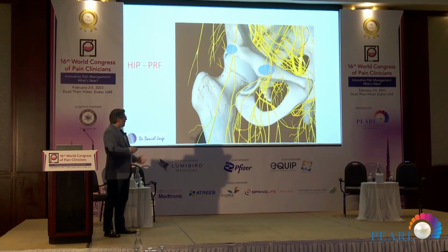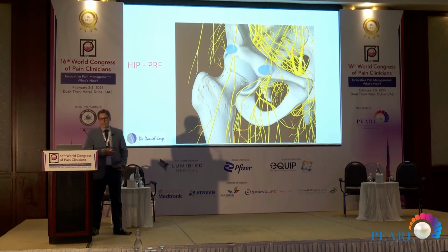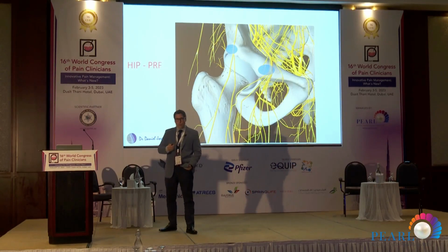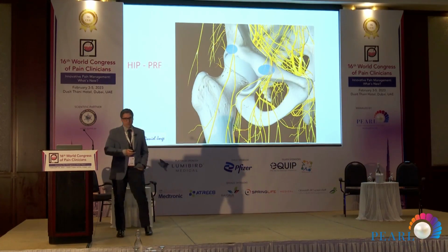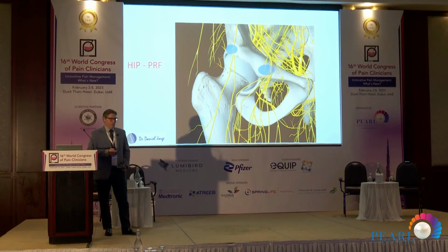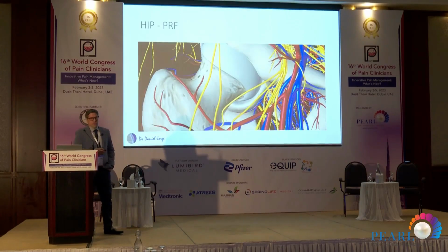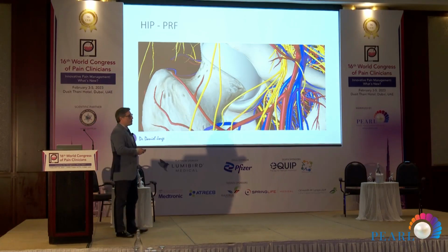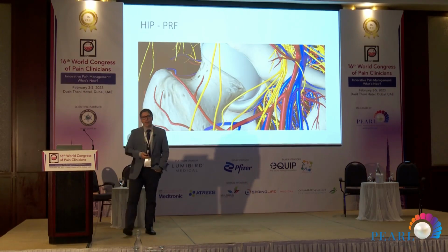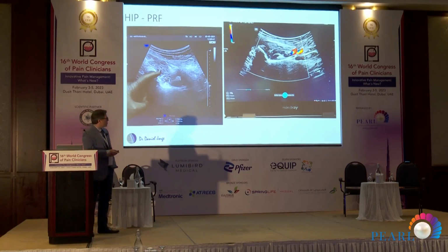For the hip, we have some good indications. We know that it's a big joint, and big joints may not respond as well as small joints to the pulse radiofrequency. Maybe we need to combine with some continuous radiofrequency when the patient is full of pain. But we can assure that it's the joint that benefits most from using the ultrasound to guide your procedure, as we have the vessels and the femoral nerve there, and you have to be aware of those structures.